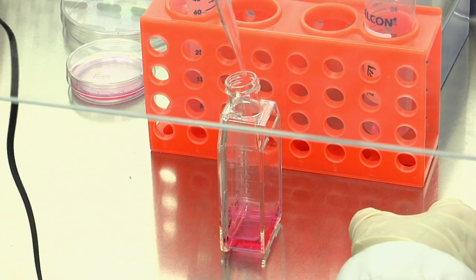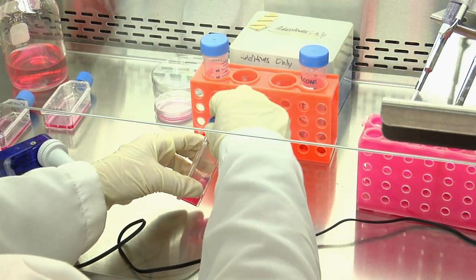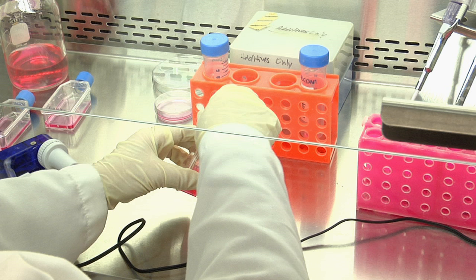Remove the pipette and immediately place the cap back on. Tighten the cap. The new cap should have a membrane that permits the exchange of gas, thus it can be tightly closed.